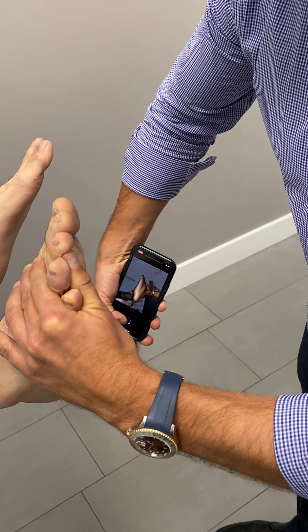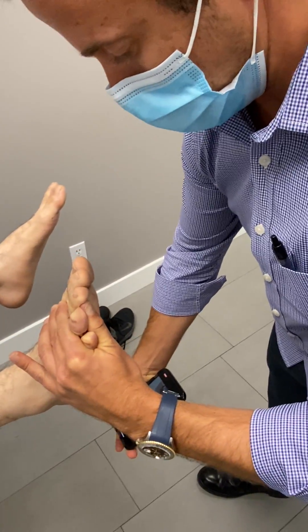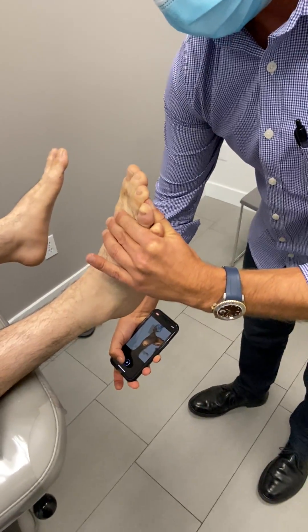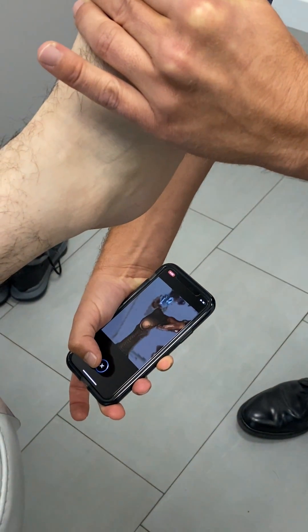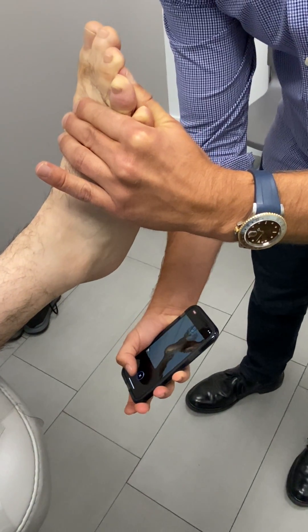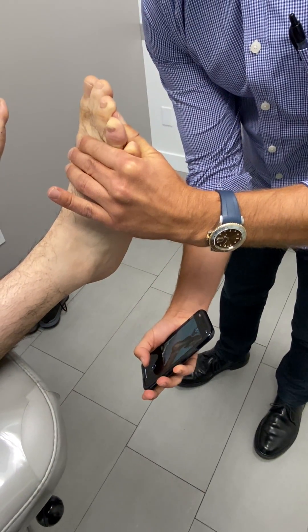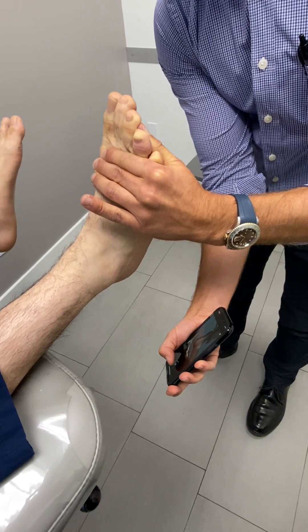I'm going to get the back of the leg here. When it goes red like that, just slow it down and back it up. Then I'm going to get the lateral side — perfect. Now I'm going to hit the X button with my thumb.